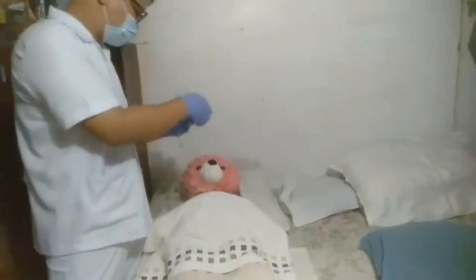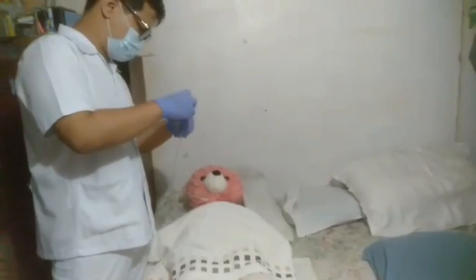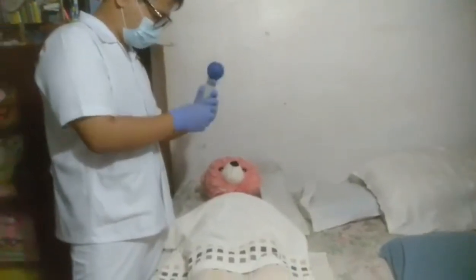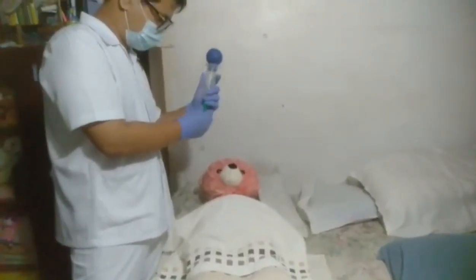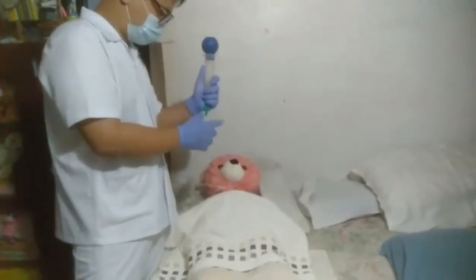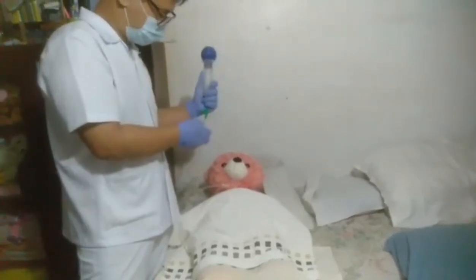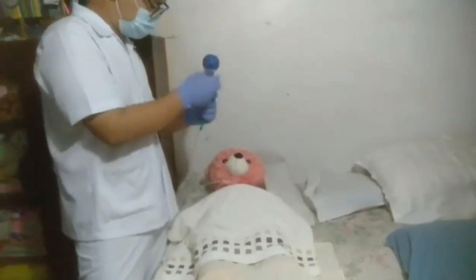Disconnect tubing for feeding from NG tube. Insert tip of a septo syringe into a gastric tube. Release the NG tube. Pull plunger back using a constant gentle pressure to check the residue. After noting the amount, replace the residual feeding back into the stomach. Fold NG tube over the clamp with the fingers.